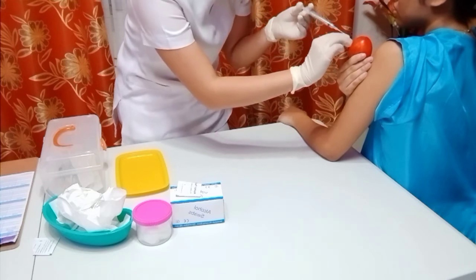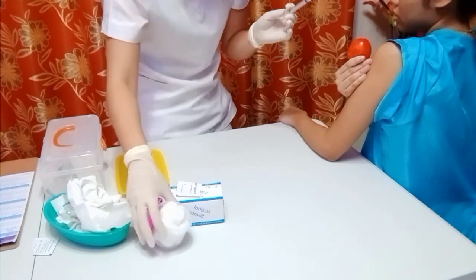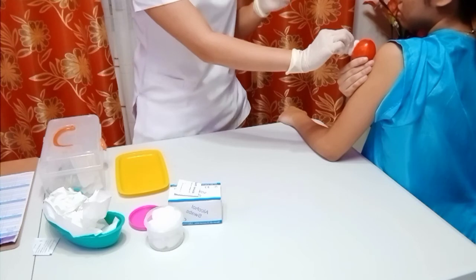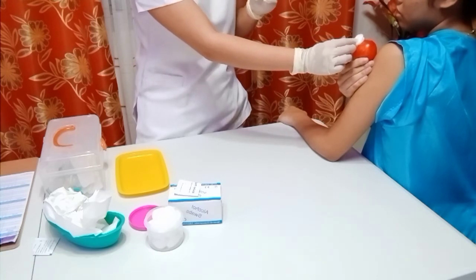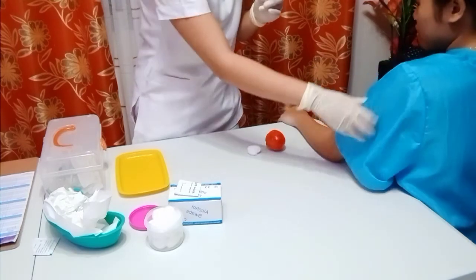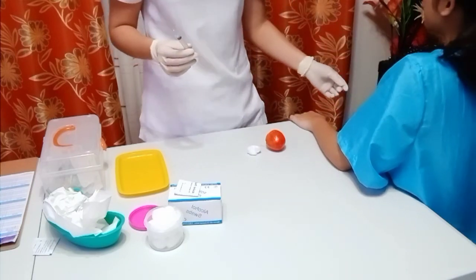Next is to quickly withdraw the needle at the angle at which it was inserted and apply a dry sponge. Slow needle withdrawal may be uncomfortable to the patient. Next is to assist the client to a comfortable position to provide client's comfort. Ma'am, lingkod lang ma'am. Okay ka ma'am, wala na ning haway mong arm ma'am. Okay ra ka? Wala. Okay ra.